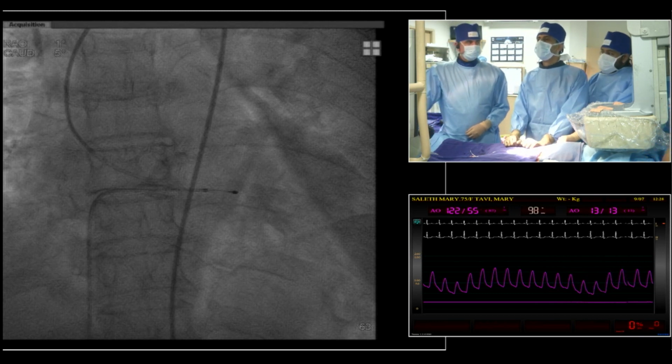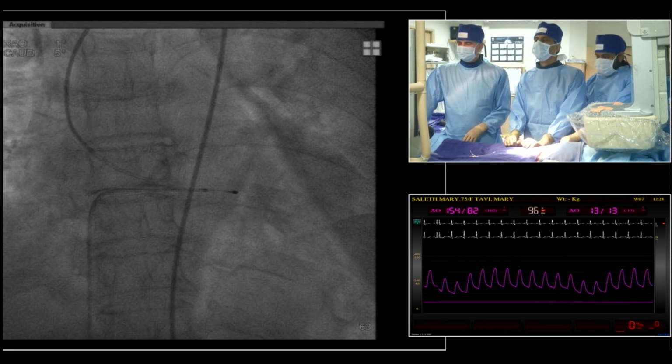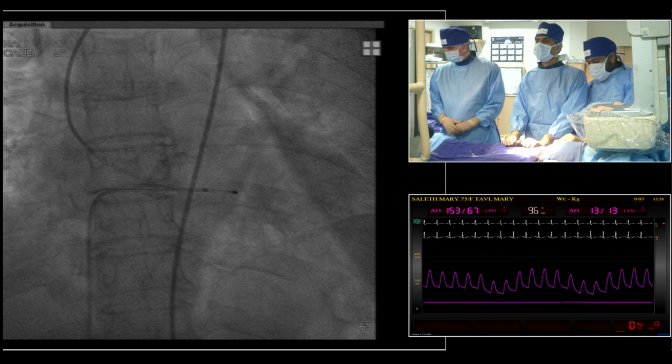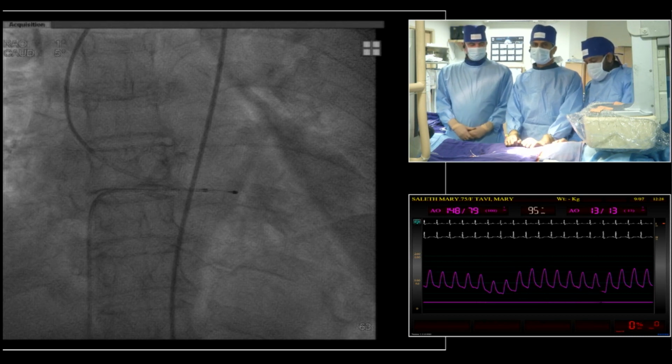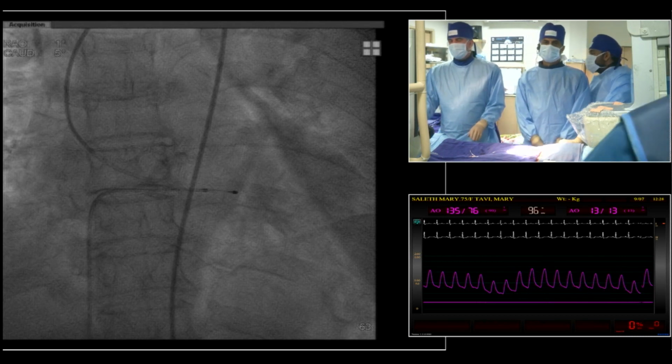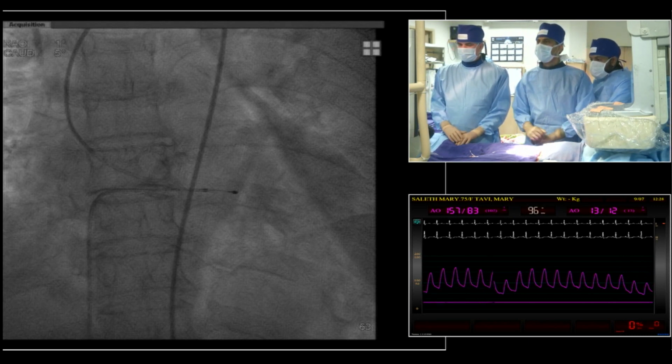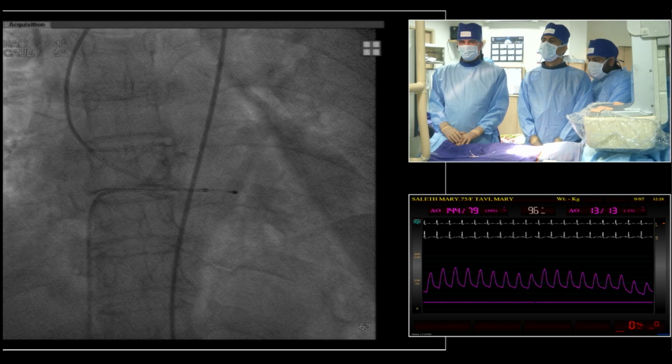That's understandable because you decrease the pressure on that side completely. It's helped by the fact that emergent access can be had if you leave an overnight wire crossover. You've already done the crossover earlier, so you can always leave a wire soon after the Perclose has been placed.